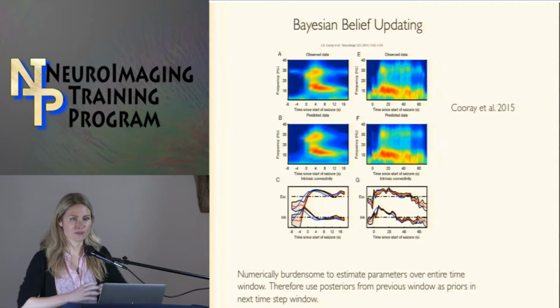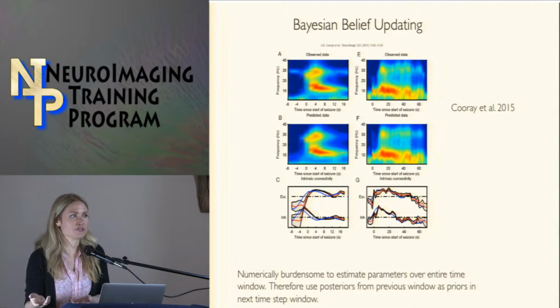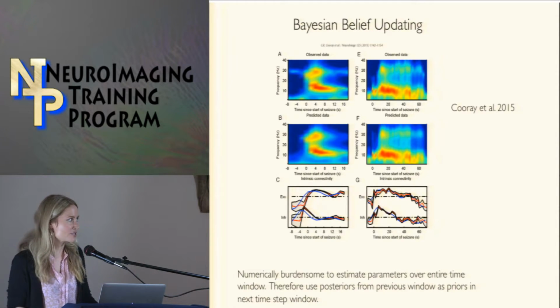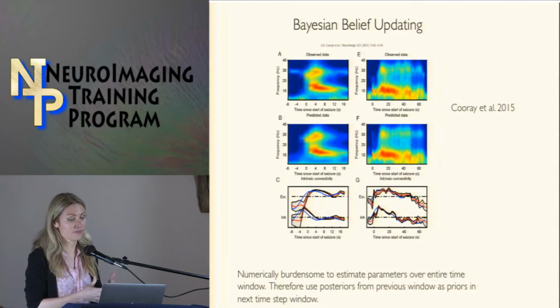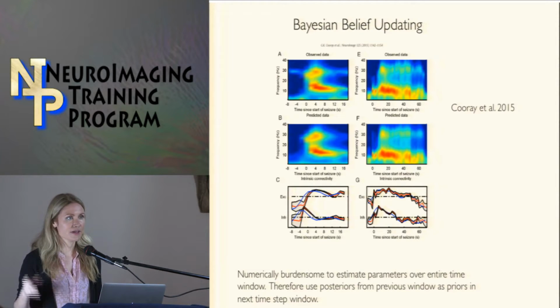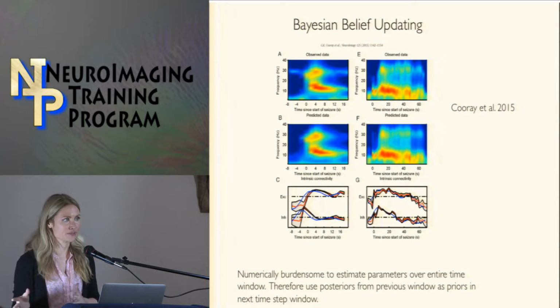But what we had was not repetitive trials. We didn't have 100 trials to epoch and then average. We just had this long recording where at some point someone would have a seizure. So we were looking to model not just the seizure itself and not just the time before, but how the intrinsic and extrinsic parameters changed over time leading up to the seizure.